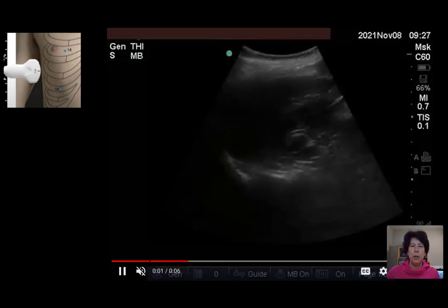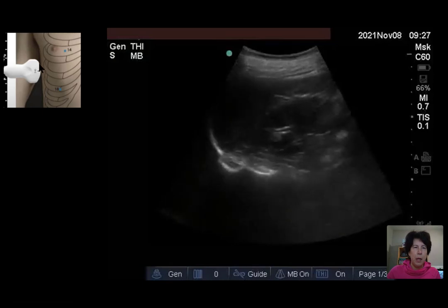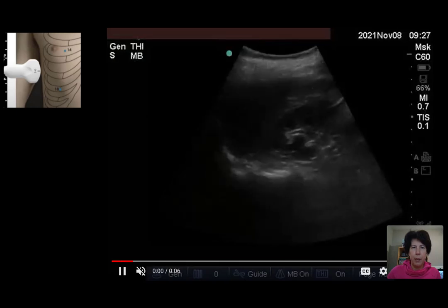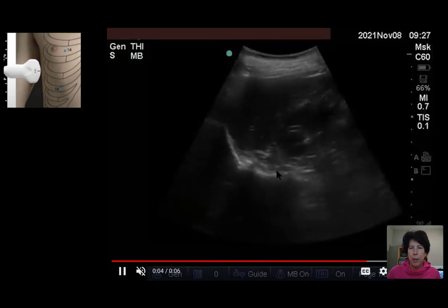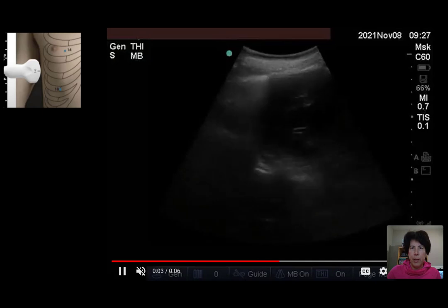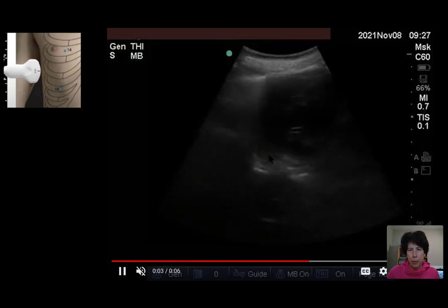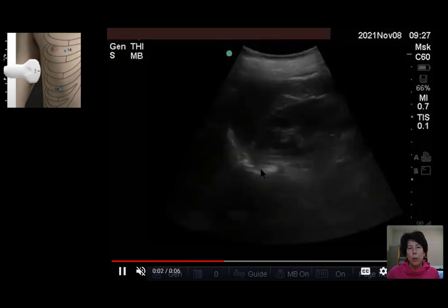So let's look at this a little bit in real time. What does that look like? This would be a scan in the right subcostal area. We would be seeing our indicator here, which is pointing up top. The diaphragm is pointing towards the indicator. We have our spine here. Here is our liver-kidney interface. And you can see what looks like a curtain coming down. That's what we call the curtain sign. That's normal. So this is what a normal subcostal would look like.